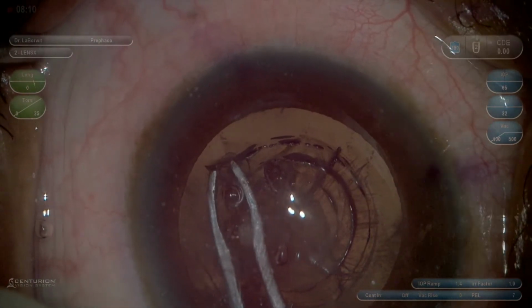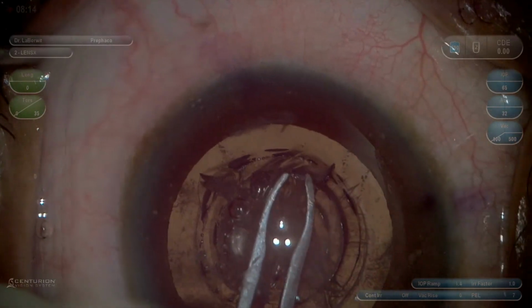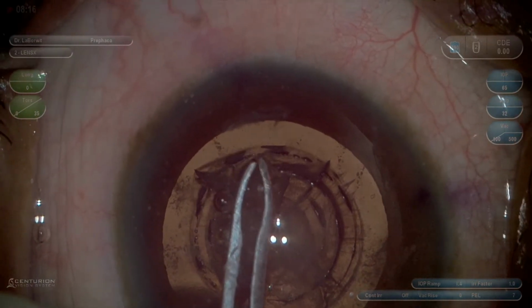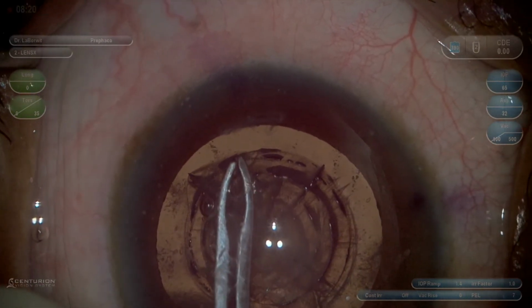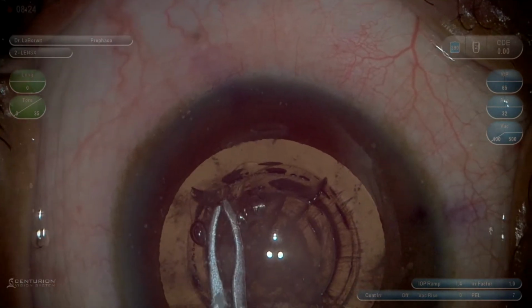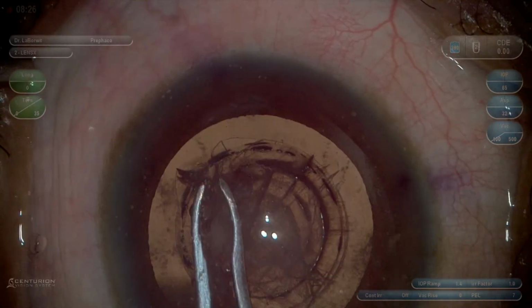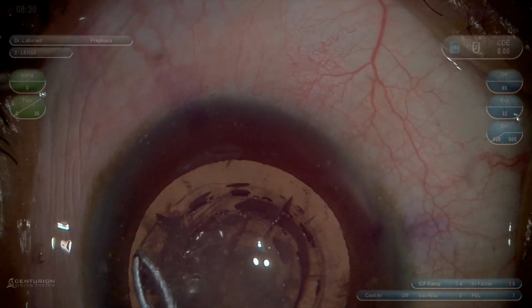Again, I just want to make sure you have the unedited version so you can see. And at that point, I decided to go from the other side, and I was able to a little more easily visualize it. It's really important to make sure when you do manually create a capsulotomy that you go outside of the intended laser capsulotomy in case there are some cuts.